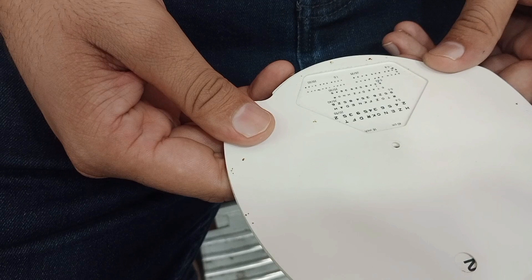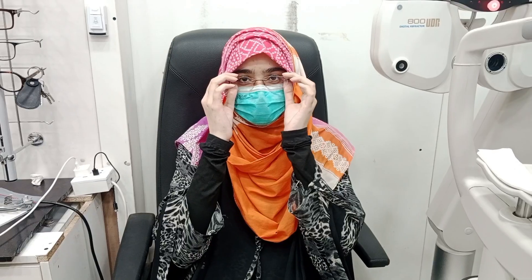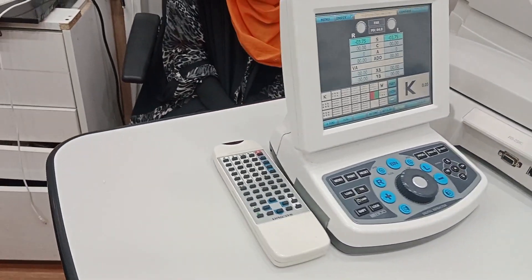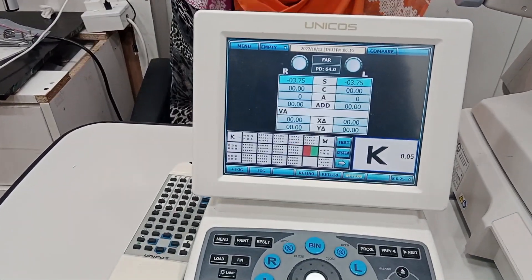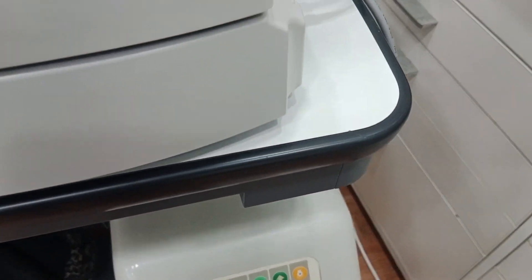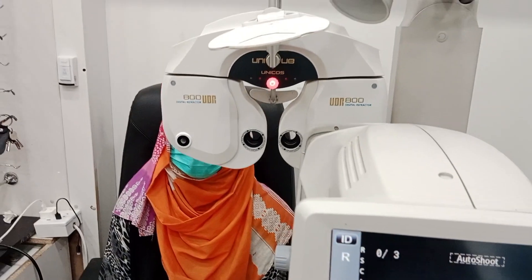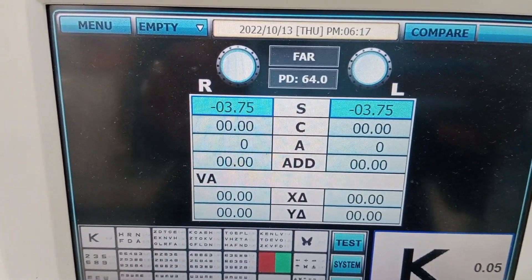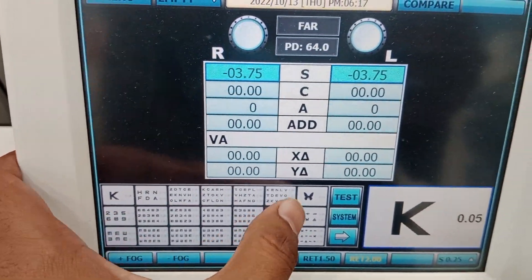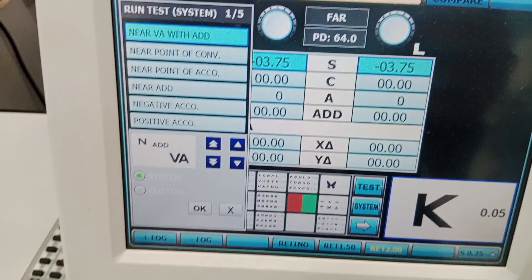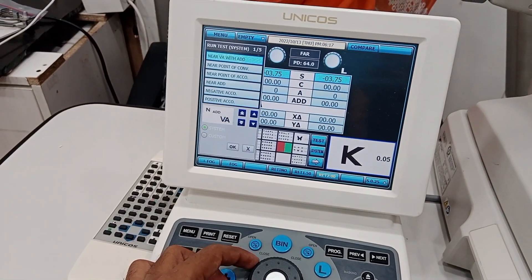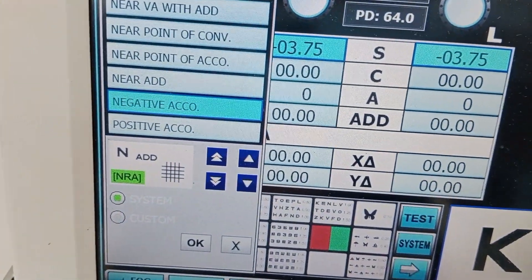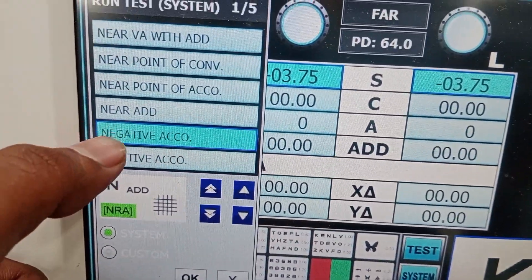The patient confirms the font is clear again at plus 2.50, so plus 2.50 is our NRA — the negative relative accommodation. We now repeat the same procedure using the phoropter. The patient's best corrected distance prescription is minus 3.75 in both eyes. We set the phoropter and find the negative relative accommodation test by rotating the knob.